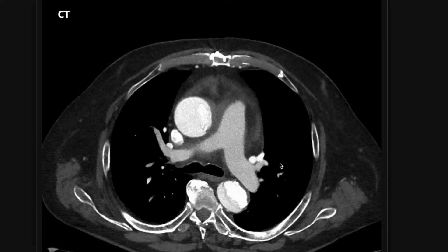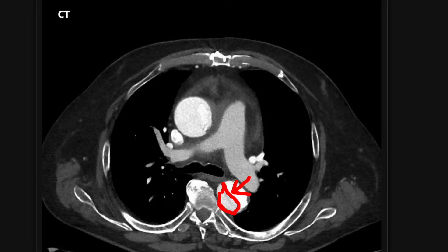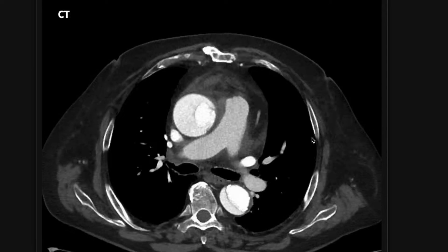To make the diagnosis, the first thing to think about is that you're going to see a dissection flap in the aorta. That line here is separating a brighter area from a darker area. Here's the darker area. That's our dissection, and that's the flap separating these two sections.